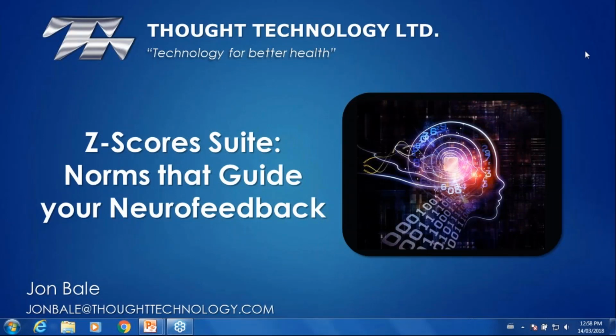This webinar in the ongoing webinar series is Z-Score Suite, Norms that Guide Your Neurofeedback. The reason we decided we want to talk about the Z-Score suite that Thought Technology has to offer is because people, frankly, don't even realize it exists. Whenever we show up to conferences that focus more on neurofeedback or brain training, they always seem a little bit shocked that we actually offer solutions where you can have a database that guides your neurofeedback training.